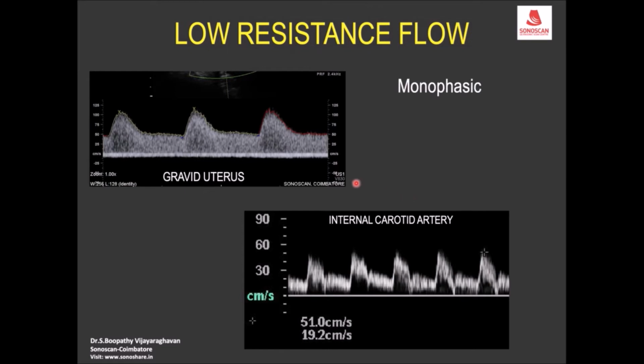What are the characters? It is monophasic. It is seen only above the baseline, and it has a low peak.